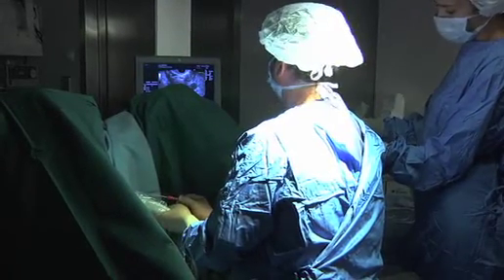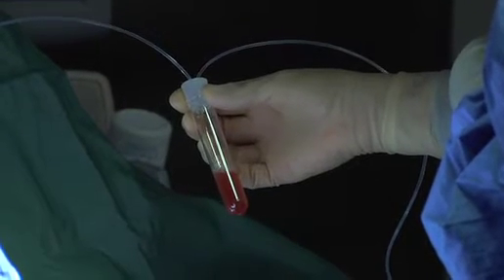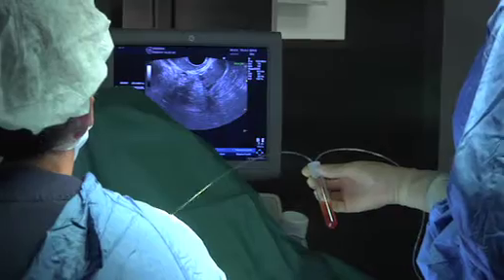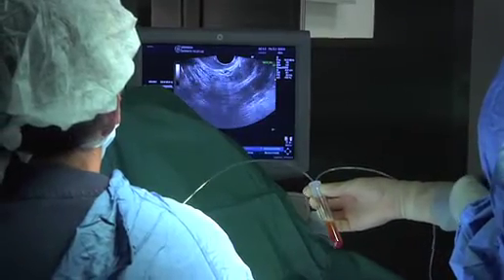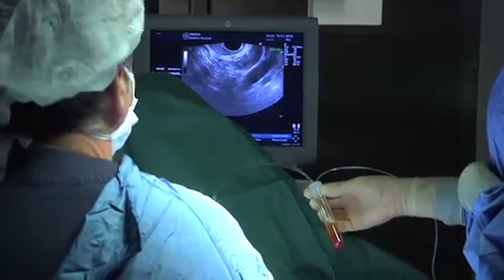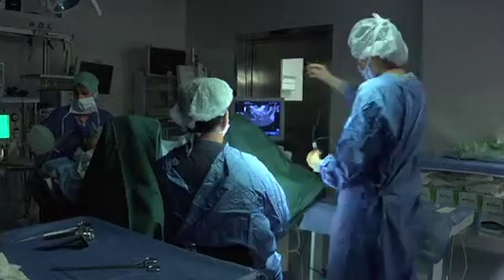As you can see through the tube, the follicular fluid is aspirated. These are the tubes where the follicular fluid is collected. It is completely sterile, held by the nurse until it is filled up and then the tube is brought to the lab. Between one ovary and the other, the needle is rinsed by aspirating culture medium.